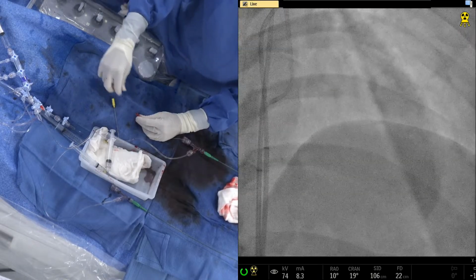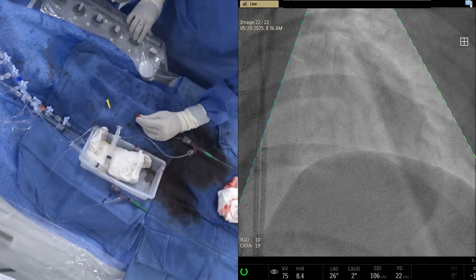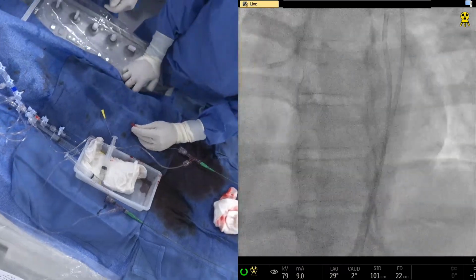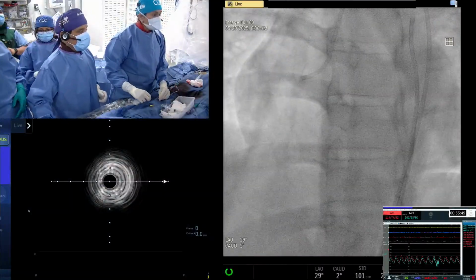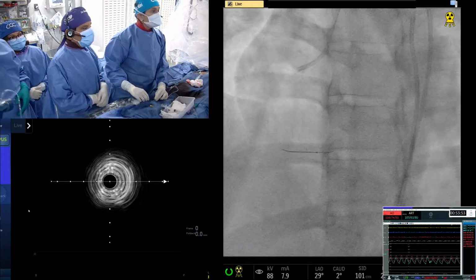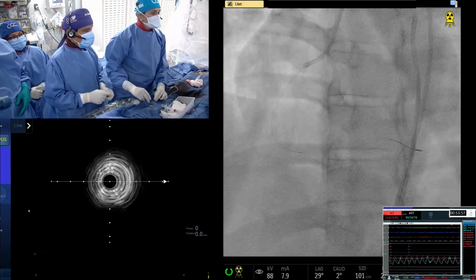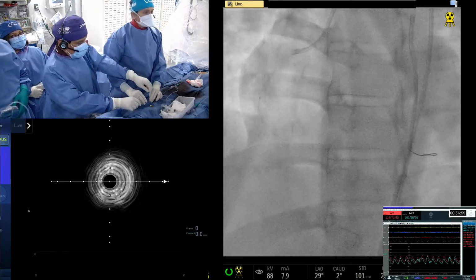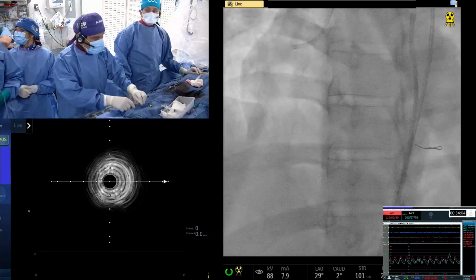So IVUS is now ready. Just to share that, Cardiac Cath wires are not available in India that freely, so that's okay. You don't need it, and we'll show you this, particularly the wire going through. This is our Corsair. No, this is a fine cross actually. So what you do is see this now.